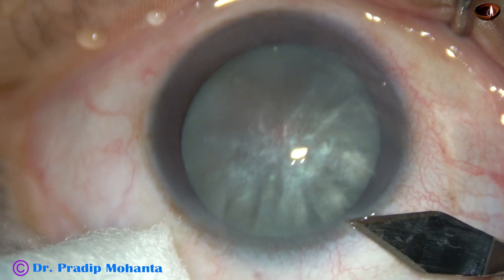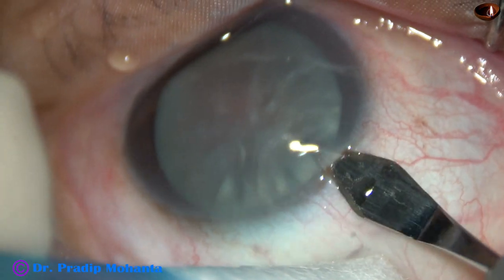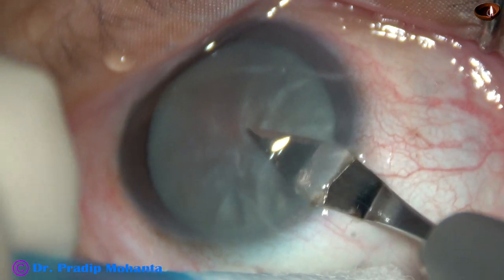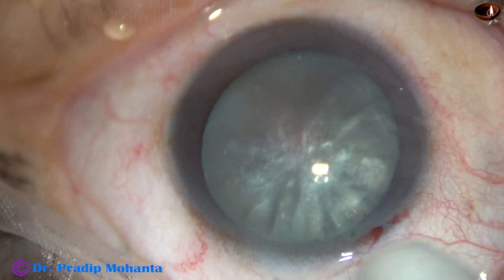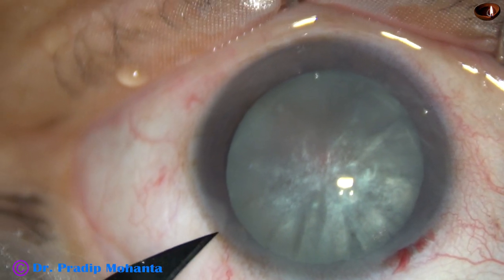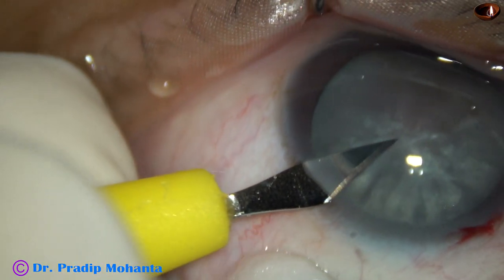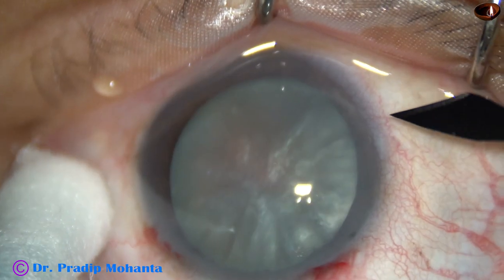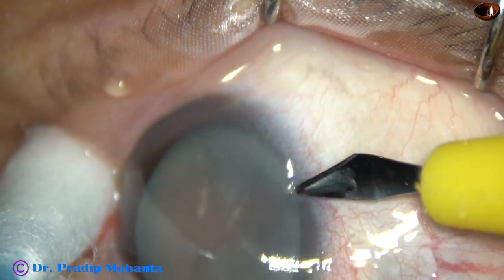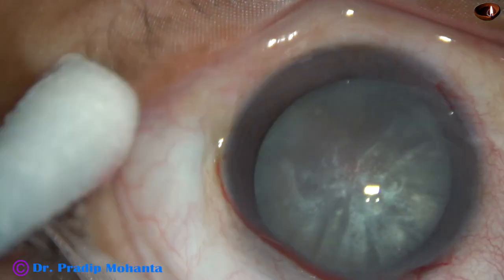This is the main incision on the posterior aspect of the limbus with a 2.8 mm steel keratome. Two side ports are made in this case — one on the left side of the main incision about 2.5 clock hours away, and another on the right side about 3.5 clock hours away.